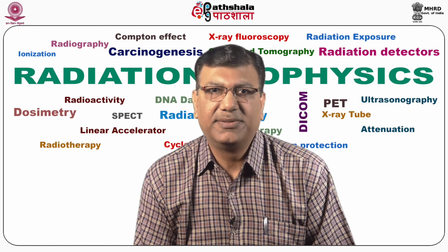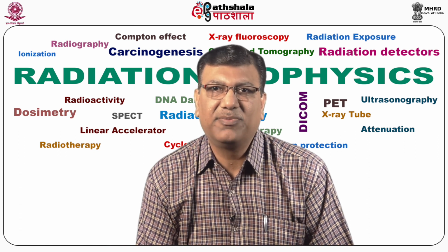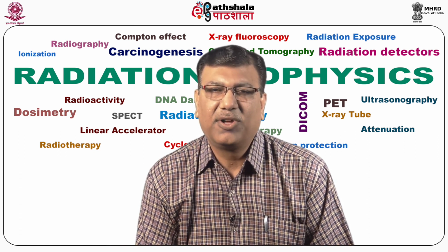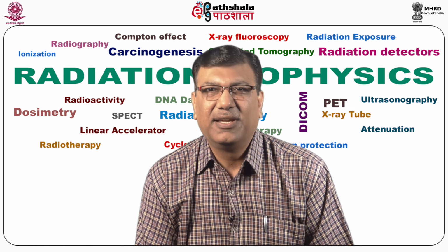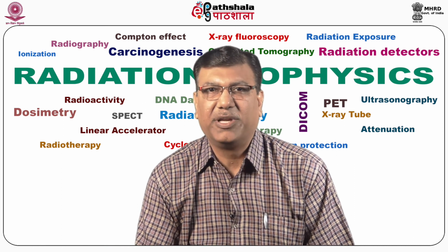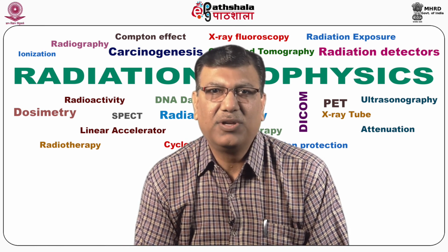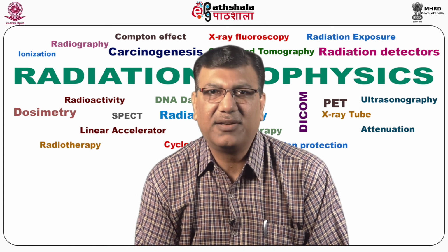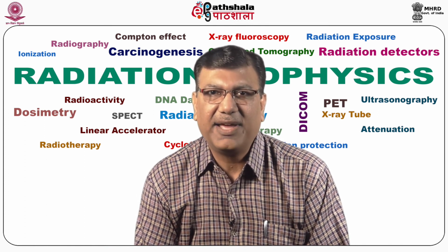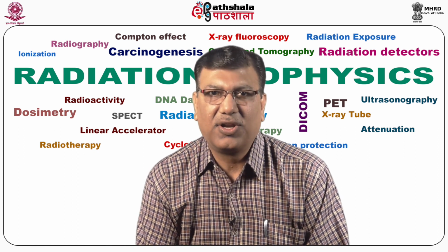Transmission ionizing chamber. The aim of putting this chamber is delivering precise and uniform radiation dose, and it serves the following purposes: monitoring and control of dose delivery, whether in X-ray or electron beam mode; dose rate monitoring, beam uniformity and symmetry and flattening monitoring; automatic treatment termination control if any of the above should lie outside acceptable tolerances.